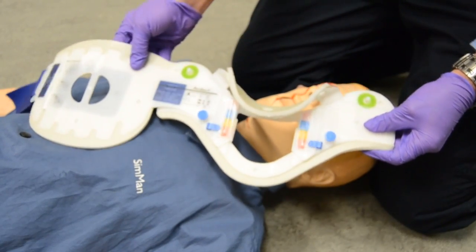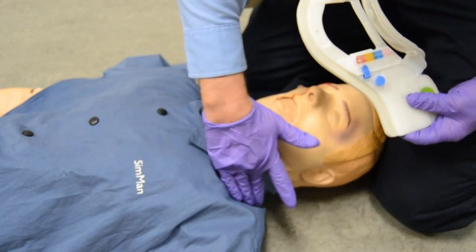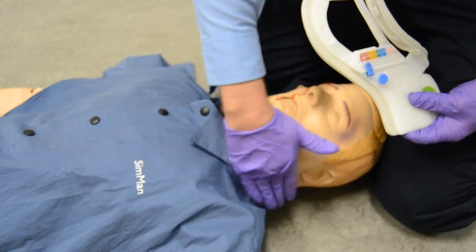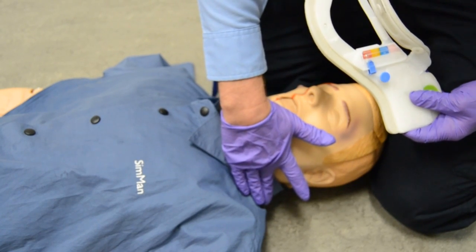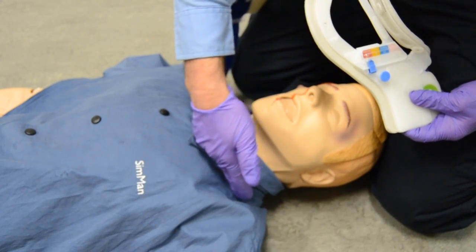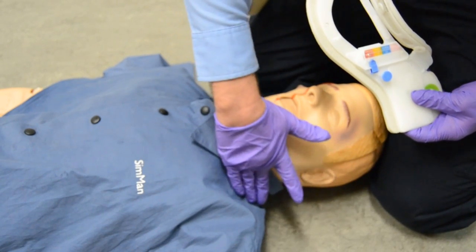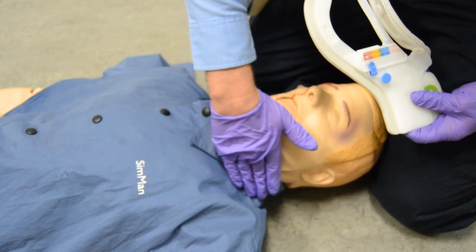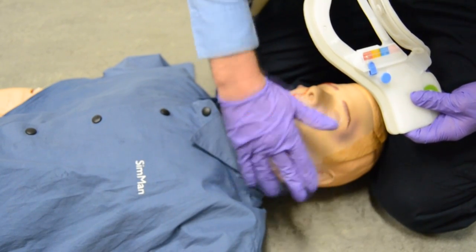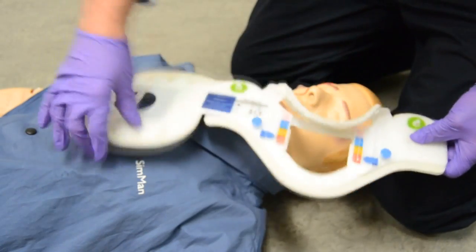For sizing this collar, we have to find out how high we're going to need it. We take our fingers on the patient, place them on the top of the shoulder, and see how far the distance is from the top of the shoulder to the bottom of the chin. If I size this up, it's about a three-finger width — maybe four on some people, maybe two, depending on how big your hand is. For me it's three.